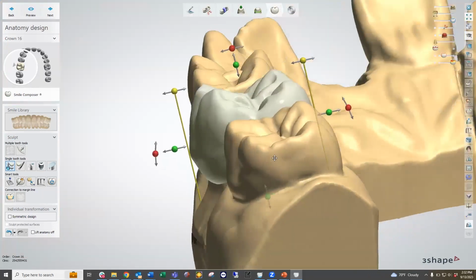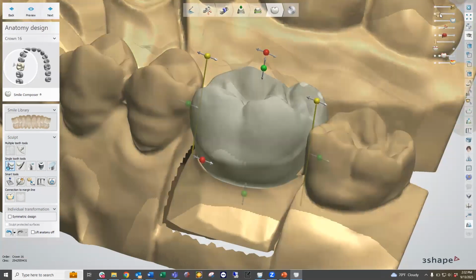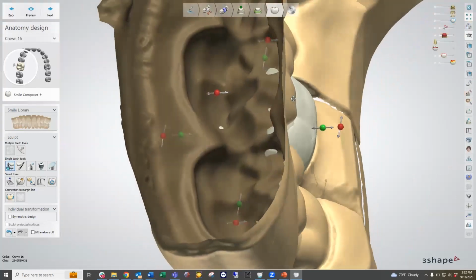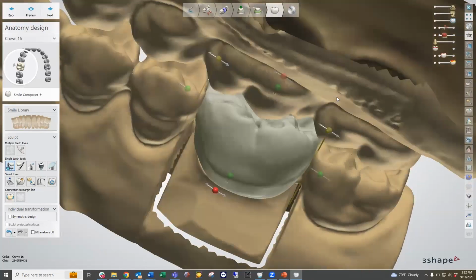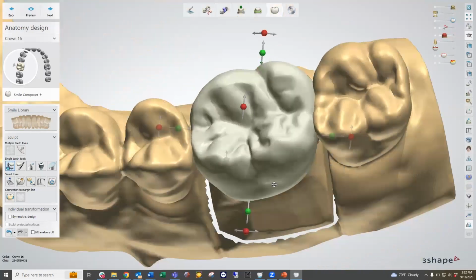So just like we had in the prepare stage, we can also see our visual sliders over here. In the upper right-hand corner, we have the option to turn on our opposing scan so we can see exactly where that tooth is going to sit within our opposing. And we have a good relation right now. So I'm going to go ahead and make just a few adjustments relative to this, and then turn that back off and just focus on the design itself.